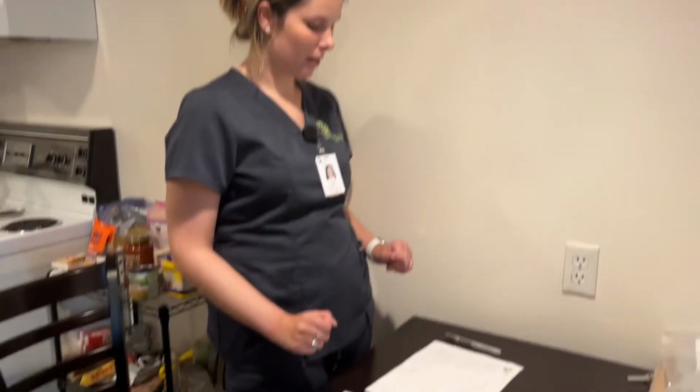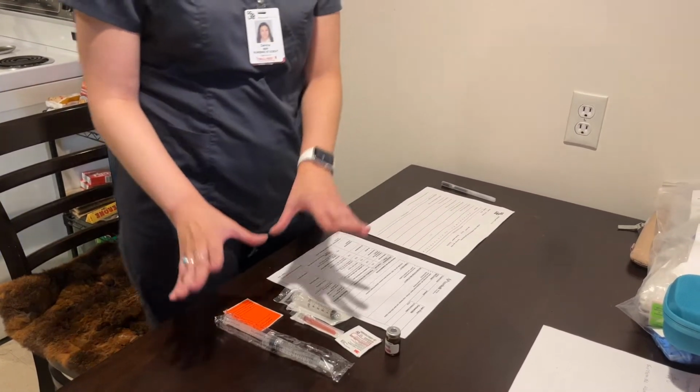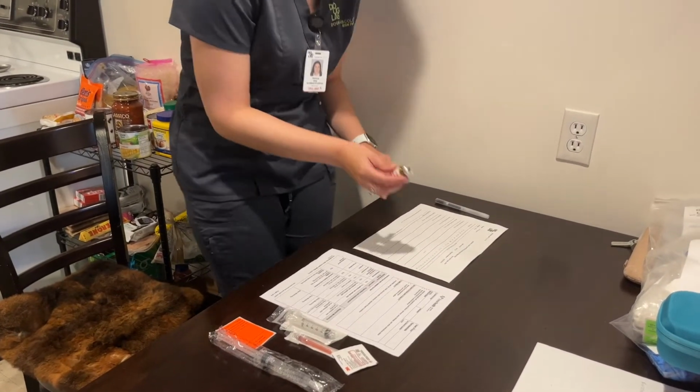So first I'm going to check the physician's order just to confirm with the MAR that I have the correct order. Now I'm just going to look at the order on the MAR for furosemide. I'm just going to gather all my equipment. So I have furosemide right here.